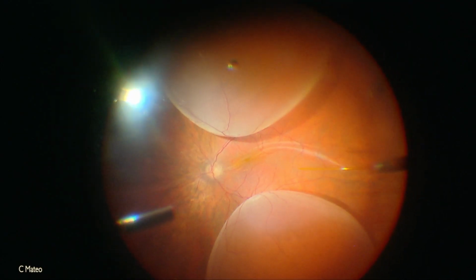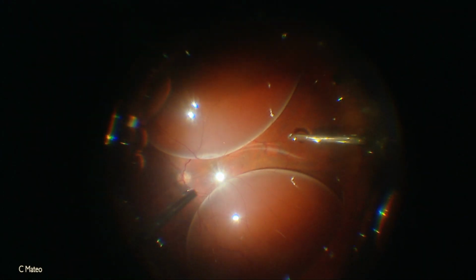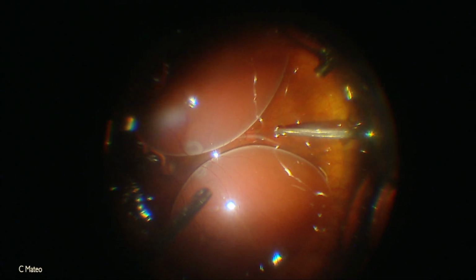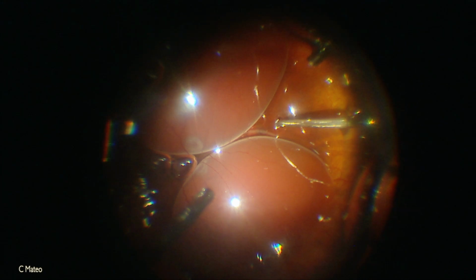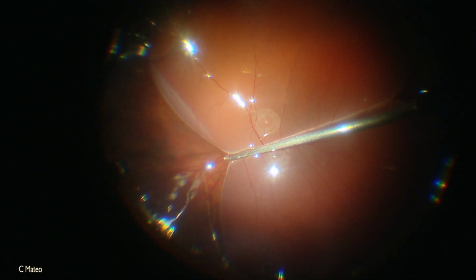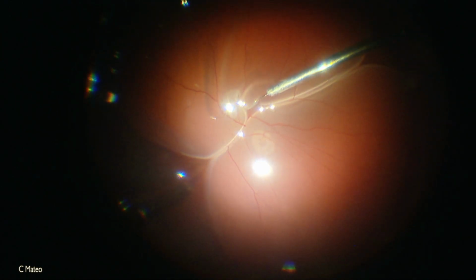We have to remember that when we inject in the mid-periphery, subretinal fluid tends to detach the more anterior retina. Then, to detach the macular area, fluid exchange is performed, collecting the subretinal fluid in the posterior part of the eye. As you can see, we aspirate alternately in the temporal zone and over the optic disc to eliminate to the maximum the fluid on the retina, and at the same time, the air pushes the subretinal fluid towards the posterior pole. With a flexible loop, we move the retina very gently to make these subretinal bubbles join.